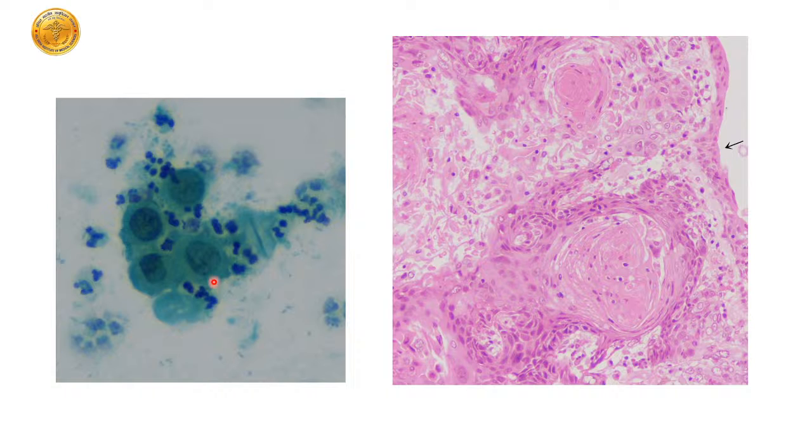Right. So another case, now that we go back, we just called these cells atypical. We called them atypical to suspicious. We were sitting on the fence because it had a lot of neutrophilic infiltration. There were these loosely cohesive cells, did not have a lot of hyperchromasia, but some of them showed about 70% ratio between the nucleus and the cytoplasm.